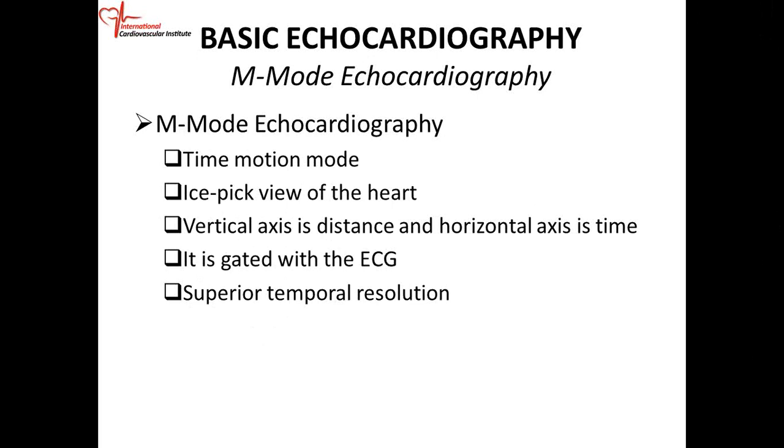One of the first questions you're going to get on your test, all tests: M mode has superior temporal resolution. M mode has superior temporal resolution. What we mean by that, it can detect very rapid motion.